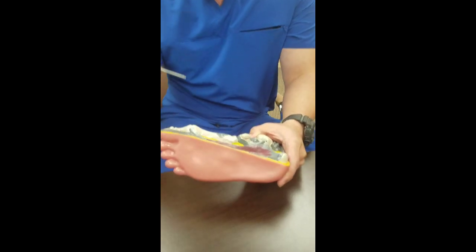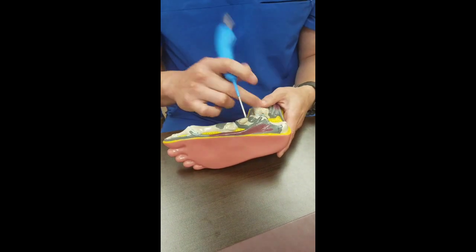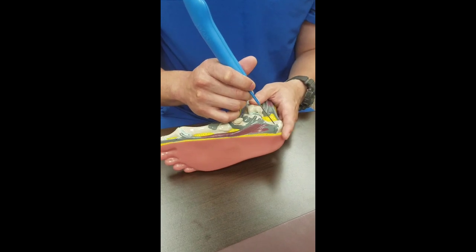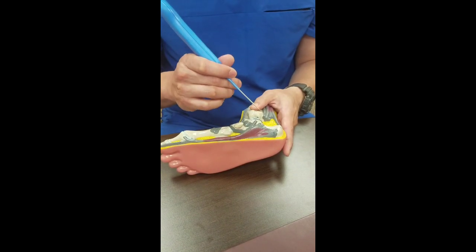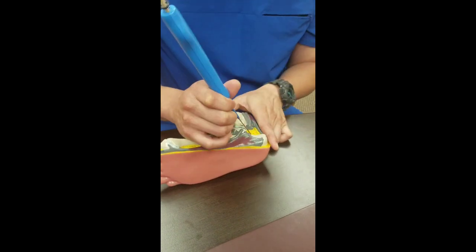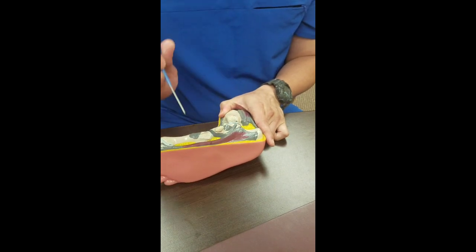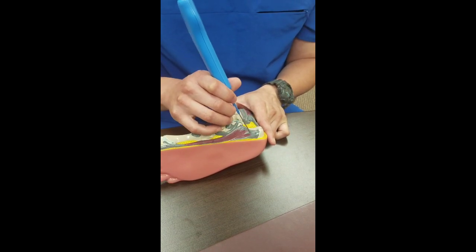So basically, with this procedure, you're brought into the operating room. They give you a little anesthesia. We numb you up and make a small little poke incision, not even a big incision, a little poke. Everything's going toward minimally invasive now. So under ultrasound, we put a little ultrasound probe down here. We can see the inflamed tissue. A lot of times we see that. We see the inflamed plantar fascia. We see normal here, and it gets hugely inflamed right here.